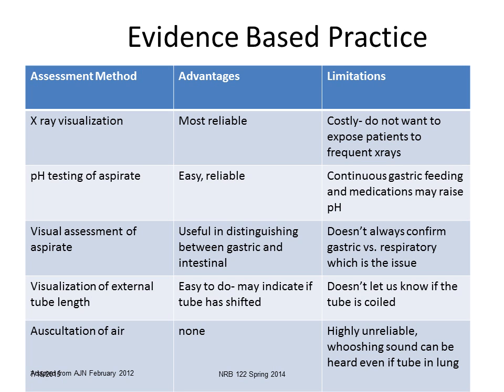We do everything in nursing based upon evidence-based practice. So, as I said, the best way to check for placement of an NG tube is by x-ray visualization. This doesn't mean that we do it every time we come in the morning. It's the initial x-ray. If the tube is in good position, then we look at how far the tube is out. We want to make sure we maintain it taped at that position. And if we ever have any reason to doubt that it's been moved or that the patient may have coughed, then we get a repeat x-ray. We're not going to use it until we're absolutely sure it's in the right spot.